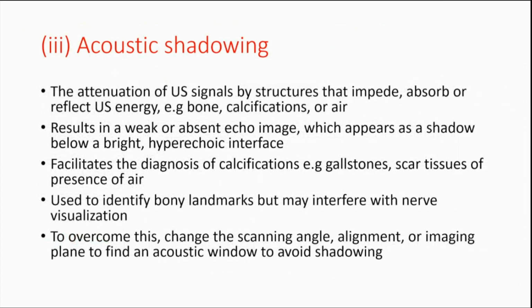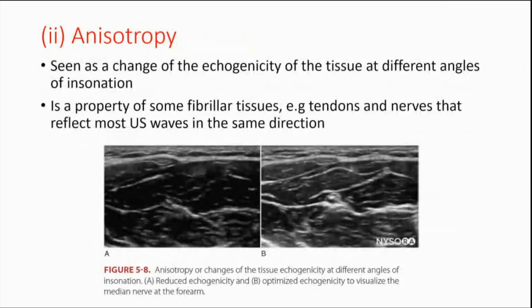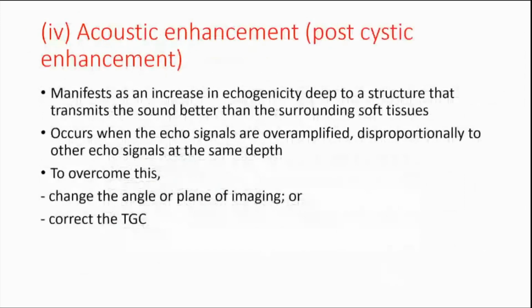It's a bit of a dry theoretical topic. It is best to be seen in practice. But I think you need to understand the machine that you have. So for example, with our Sonosite in OT, a lot of our blocks are done in such a way where the needle is in the middle of the screen.